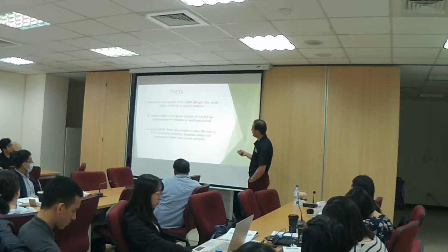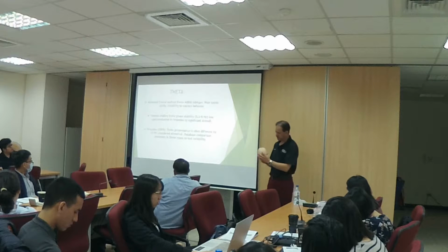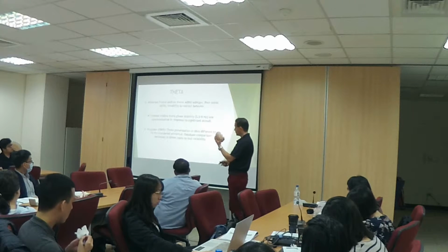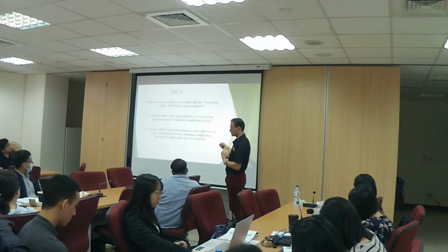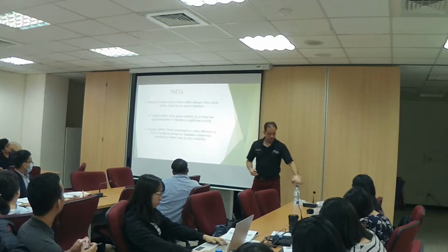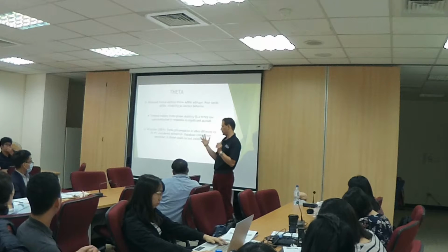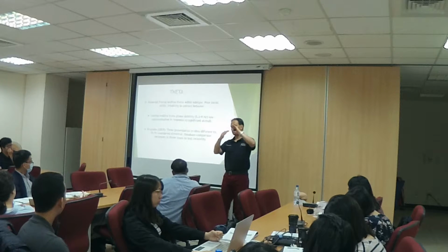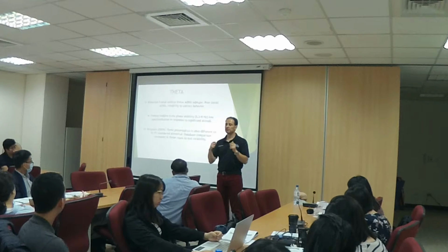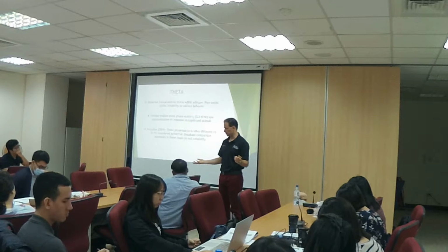So the midline theta, which is abnormal, so you see a lot of theta in your CZ, FZ cortex, is one of the ADHD subtypes. Traditionally in psychology, you go with DSM-4 or DSM-5, which lists a cluster of symptoms, and the person has to meet some of those symptoms to be diagnosed with something.